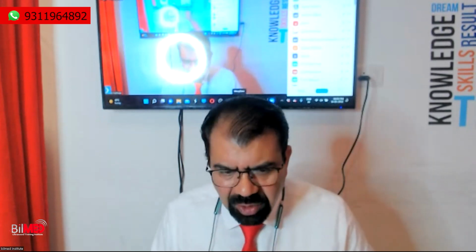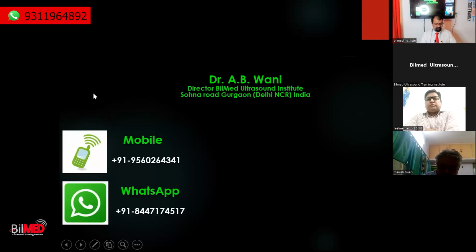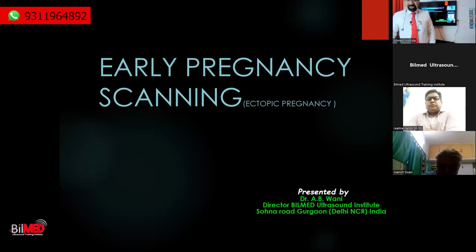So let's get started with our session. Early pregnancy ultrasound.